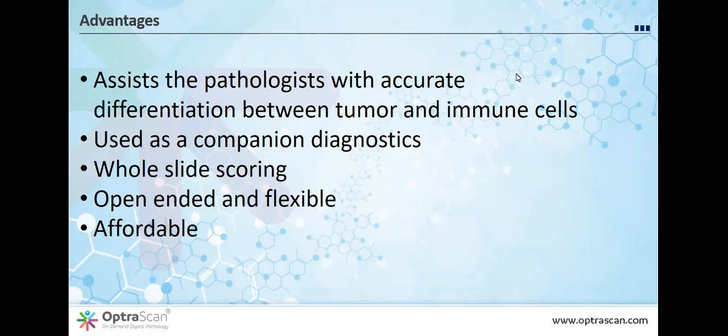It's calibrated to the pathologist. So that is good in a way because pathologists have proved astonishingly successful in visual interpretation. I mean, we've been doing it for 150 years since the microscope came into medicine. And it's still the way of diagnosing cancer, in spite of all the molecular testing and NGS and the rest of it. Nobody treats anything without a pathologist giving a tissue diagnosis. So it's amazingly accurate, but it's not so accurate once we have to count. And that's because of the complexity of identifying individual cells and retaining numbers.